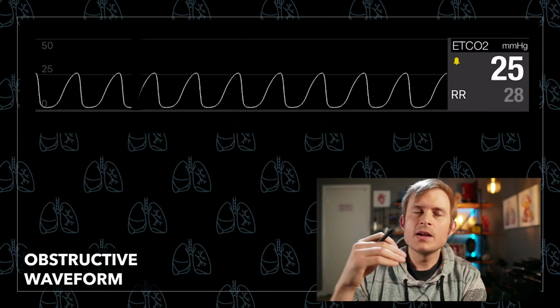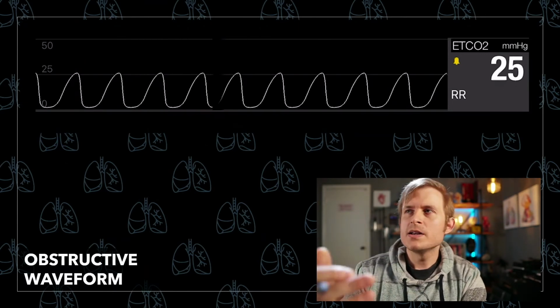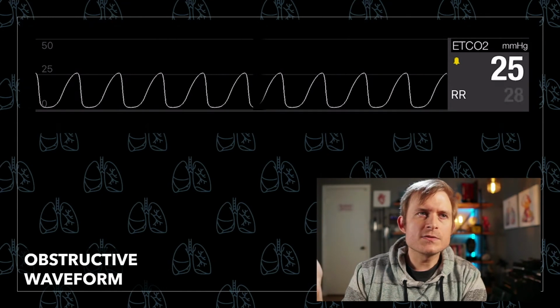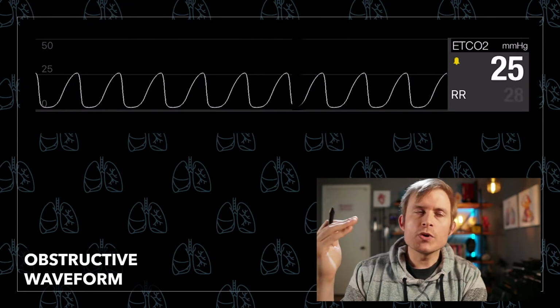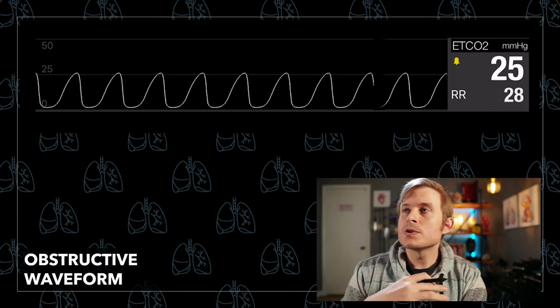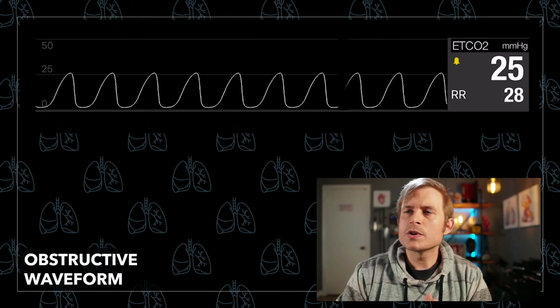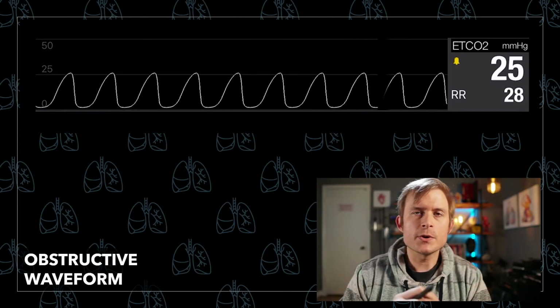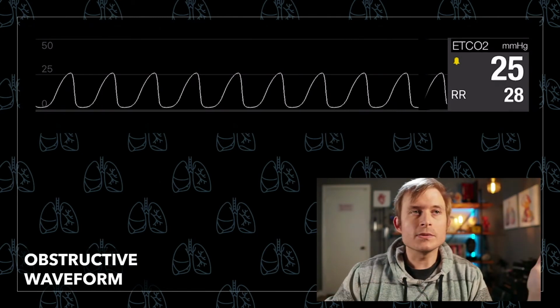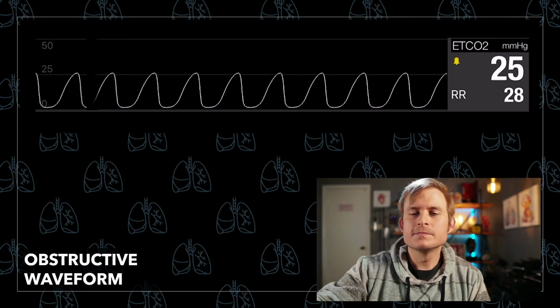So we can actually see that happen well in advance of other diagnostic tools like SpO2. End-tidal CO2 is much more sensitive to the changes in breathing rhythm and the changes in cardiac output of a patient who's suffering from a severe respiratory illness or respiratory condition. So that's why it's very important to use on any patient that you have who's asthmatic or who's critically ill.